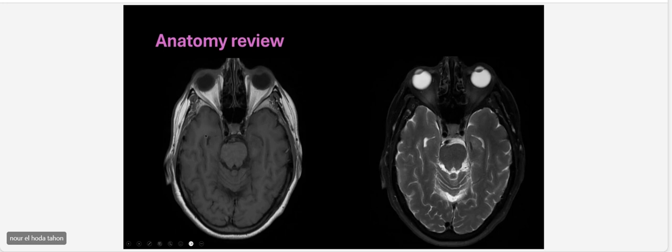And again, here you can note the difference in the white matter, but still, I can tell you something actually. It's hard to say about this because we already use the fat suppressed in these images. So the fat is suppressed, but it is dark in T2. It's dark in FLAIR, but it's not that dark because we use the fat suppression.